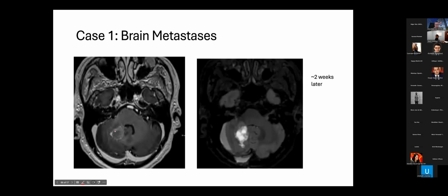When it comes to contouring, a lot of people will contour something like this, okay? And then target that with their radiosurgery dose. However, that's not really a great contour. What we want to do is include at least 2 millimeters of the rim of tissue around what we see as fluid. So something like this is a better contour.